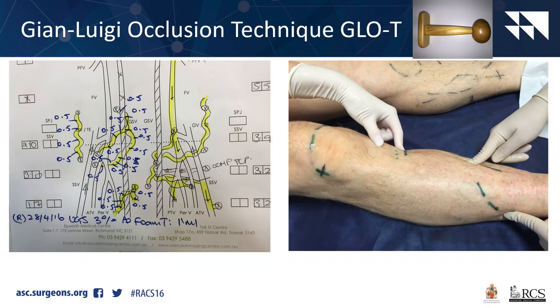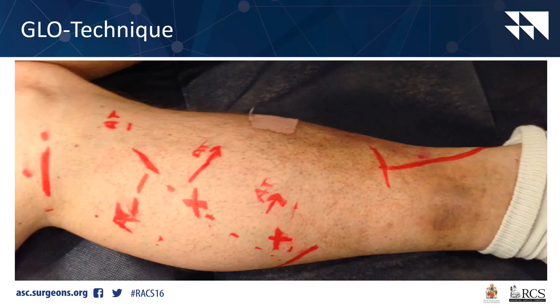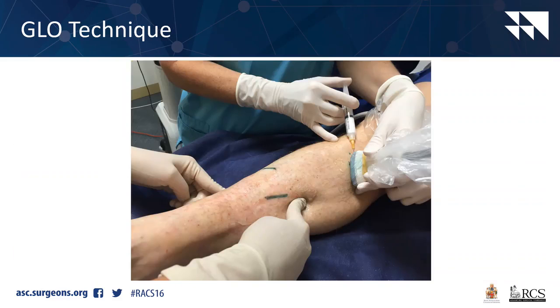We map out on the patient where all the drainage points are for the tributaries, and if it's communicating with any major trunk veins that we don't want the foam to go into. The nursing staff provide digital occlusion to stop the foam travelling. Interestingly, in the literature, people describe common side effects with foam sclerotherapy, such as chest tightness, coughing, visual disturbance, which we're told is biochemical, not embolic. I disagree, I think it is embolic because we don't see that in any of our patients.